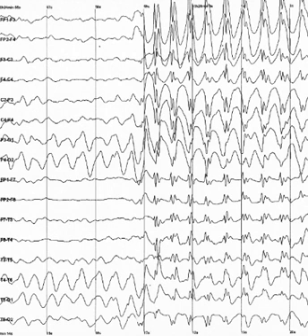The digital EEG signal is stored electronically and can be filtered for display. Typical settings for the high-pass filter and low-pass filter are 0.5 to 1 Hz and 35 to 70 Hz respectively. The high-pass filter typically filters out slow artifact, such as electrogalvanic signals and movement artifact, whereas the low-pass filter filters out high-frequency artifacts, such as electromyographic signals. An additional notch filter is typically used to remove artifact caused by electrical power lines, 60 Hz in the United States and 50 Hz in many other countries.